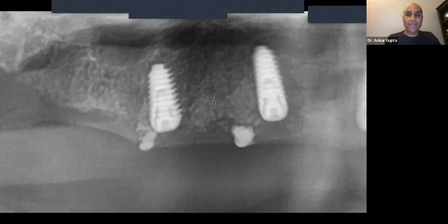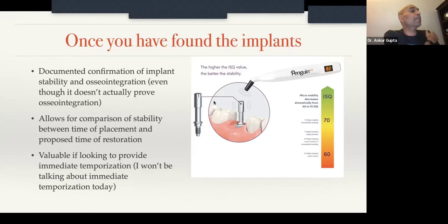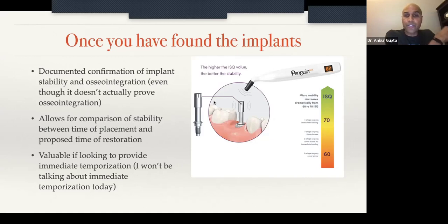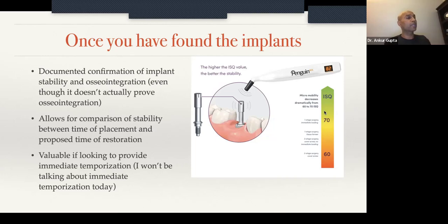Once you've found your implants, it's good to test their stability. I use something called a Penguin; another company makes something called the Osstell. I'm not sure which is better — I just happened to buy the Penguin. I screw a little metal component into my implant, then use the Penguin, which gives me an actual ISQ score showing how stable my implants are in tissue. Now I have something documentable to confirm integration and get the green light to start the restorative process.